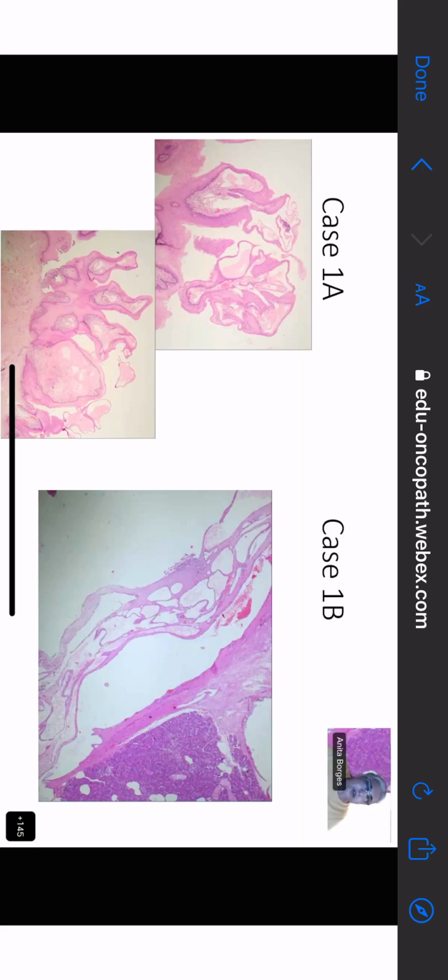There may be spots on the slide, and there may be dust and God knows what, but surely we don't want to describe that, isn't that right? Yes, ma'am.